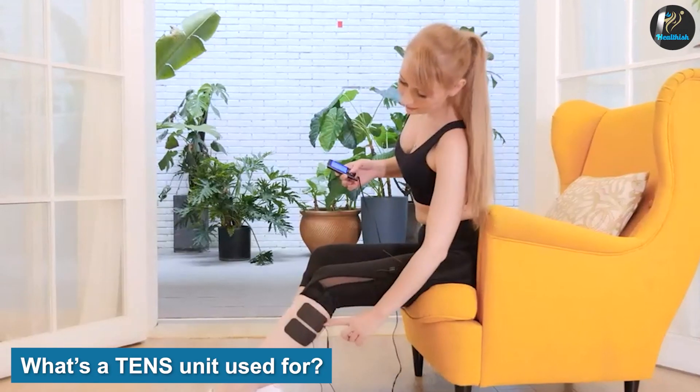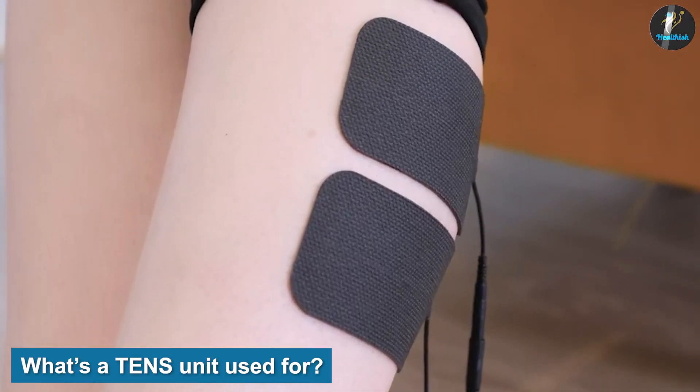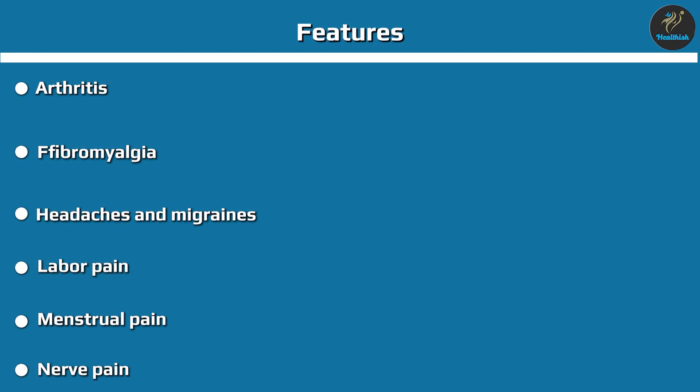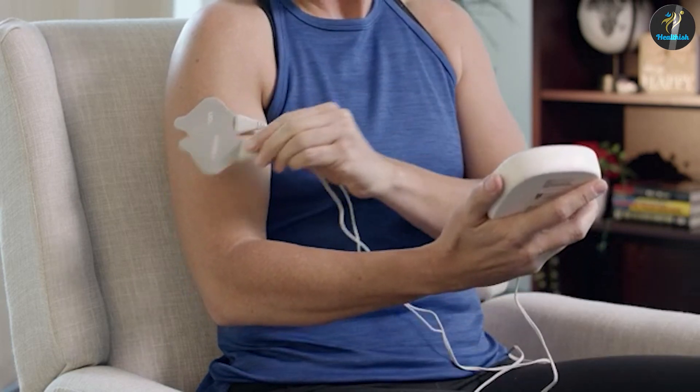What's a TENS unit used for? TENS machines may relieve pain caused by many conditions, including arthritis, fibromyalgia, headaches and migraines, labor pain, menstrual pain, nerve pain, sports injuries, surgery, wounds and incisions. People use TENS in physical therapy and pain clinics. Some hospitals also use them. And health devices are also available to purchase for at-home use.